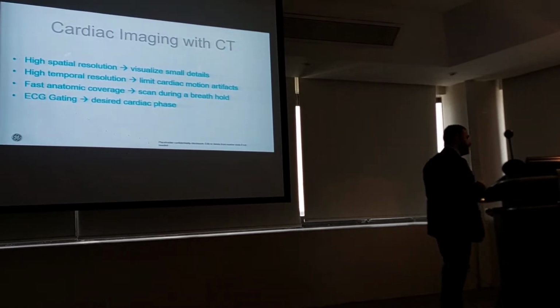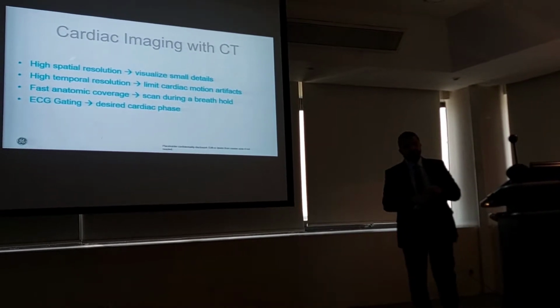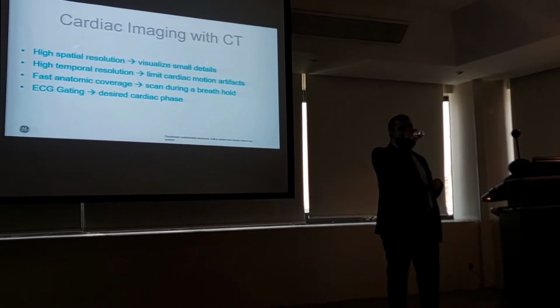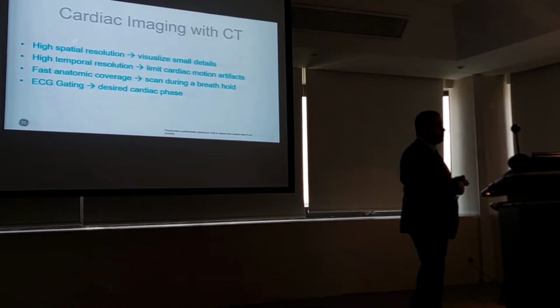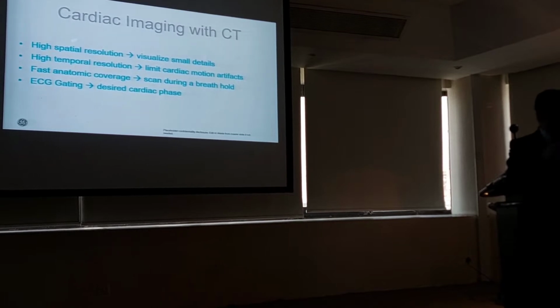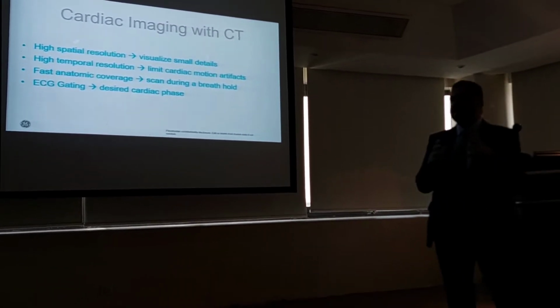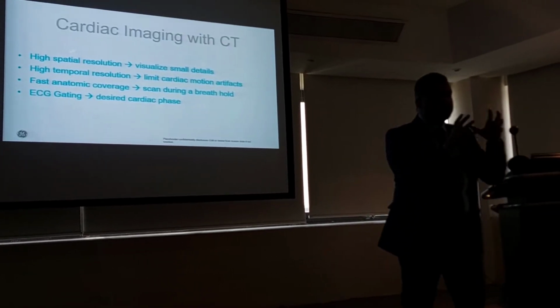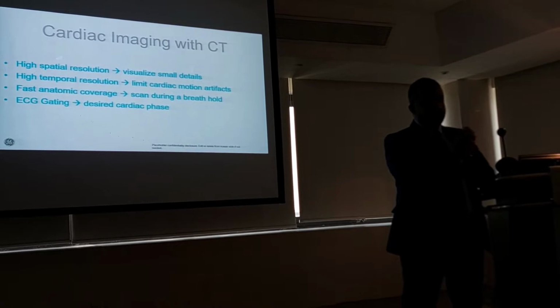And the last one is the ECG gate. So as to be able to get these done, including the temporal resolution, how fast I will capture data. Okay, I will need to find the best time to capture the data.